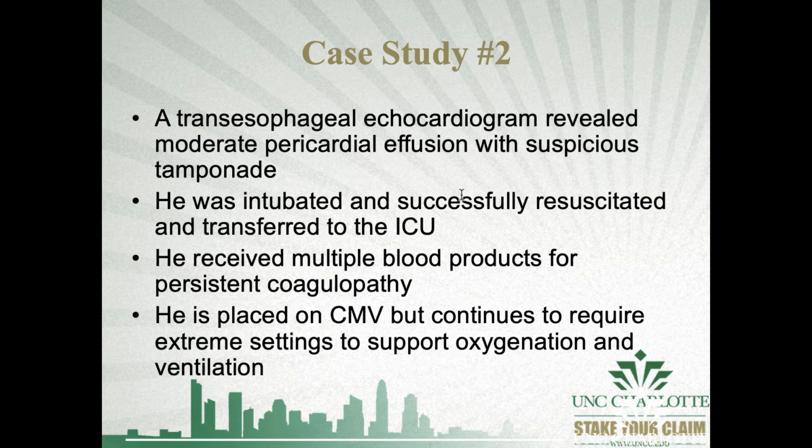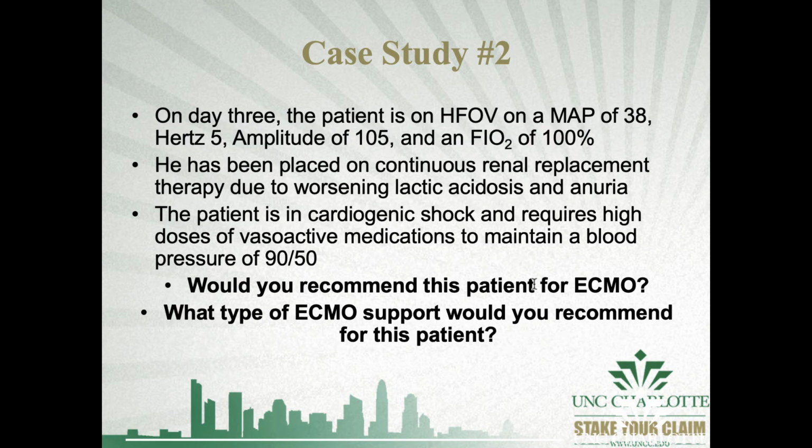He received multiple blood products for persistent coagulopathy and was placed on conventional mechanical ventilation, but requires extreme settings to support oxygenation and ventilation. 3 days in, he gets placed on the oscillator. There's another issue with the oscillator: the later you implement it, the worse the outcomes, just like anything else. But that's another issue with some of the studies that are out there.